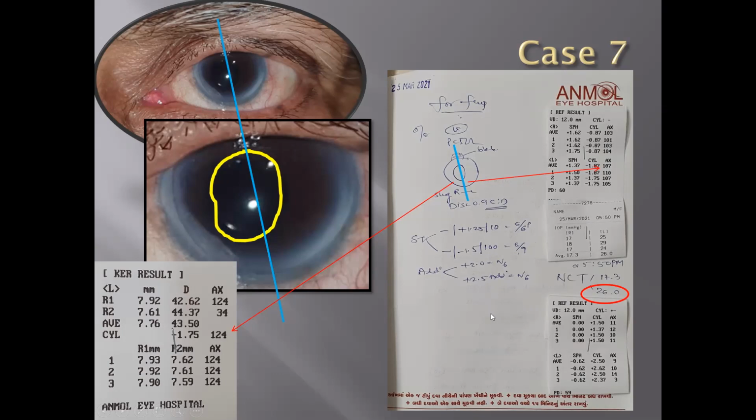so we will not give final refraction to this patient, and we will call the patient again. And you can see I have done autoref on two different machines.